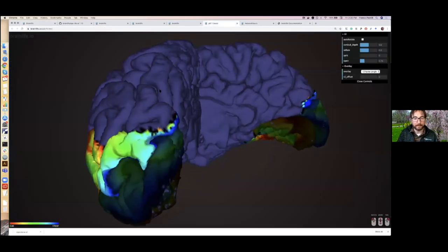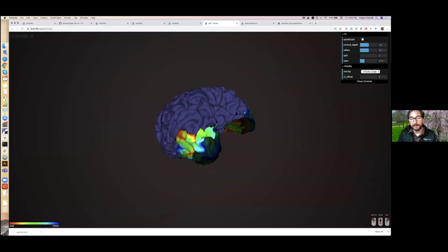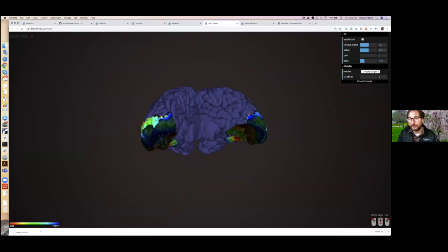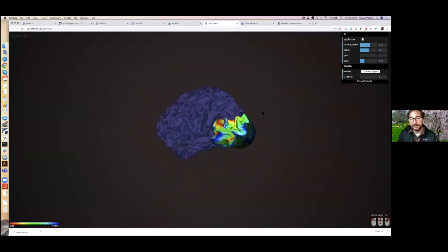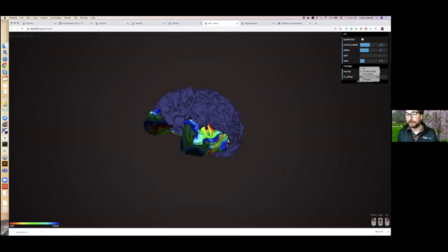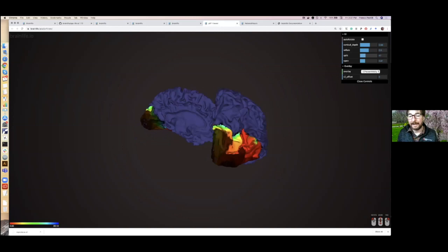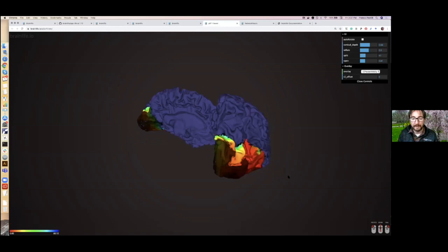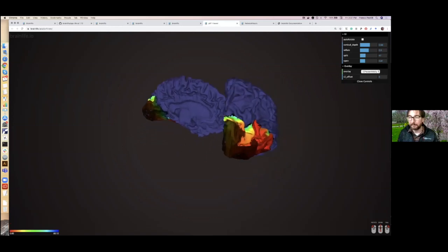So this is a visualization that we are in the process of developing. I have to say this is still beta. It's available as a demo, but it's not completely developed. It's for fMRI data analysis, in this case, we're showing population receptive field, visual cortex from the Human Connectome data developed by Benson and Kendra Kay. You can show different types of maps on the surface. You can move the brains in different ways. And again, this is meant to provide immediate or semi-immediate feedback to the user so that you can get a sense of whether your data has been processed correctly or not, etc.